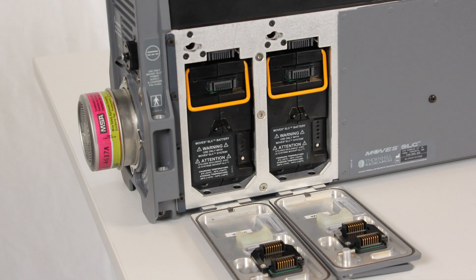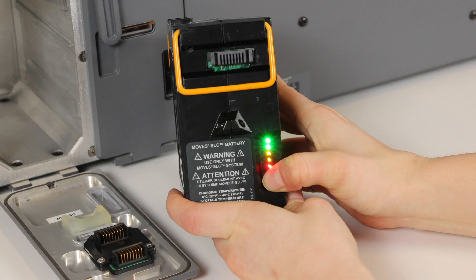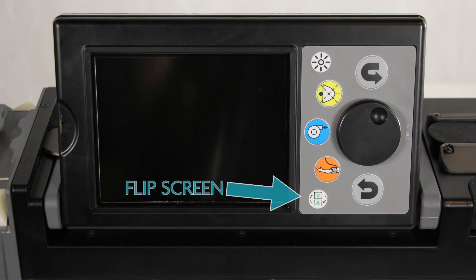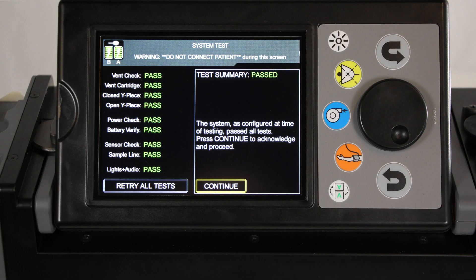MOVES SLC must be operated with at least two batteries or one battery and connection to the power supply. As required, connect the power supply to the MOVES SLC and inspect and install the batteries. Turn the MOVES SLC unit on by pressing the power control button. Press the screen orientation button if necessary to orient the screen. Press the brightness button to cycle through the brightness options. Perform the system test procedures by following the on-screen instructions.